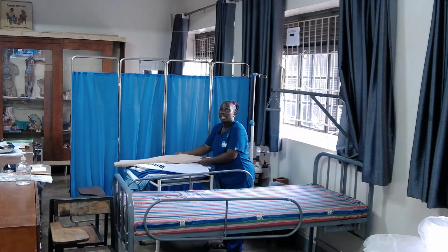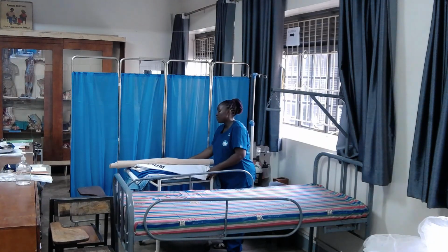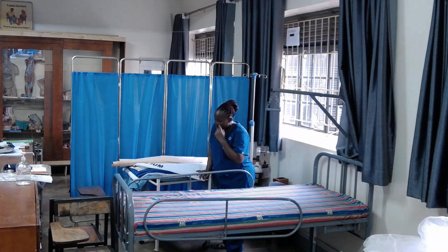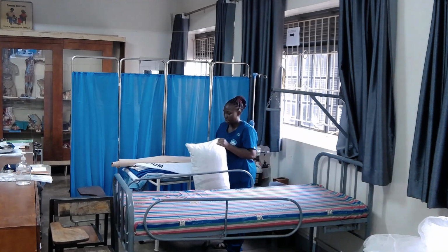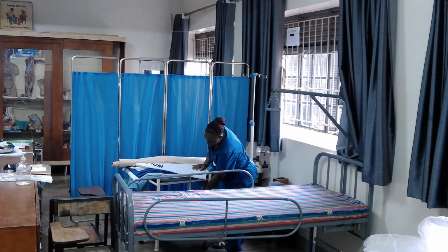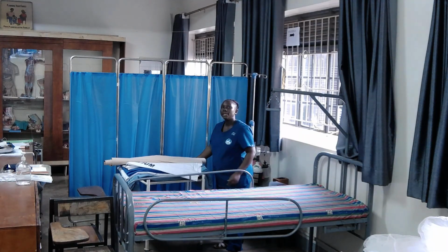So this bed is just a continuation of an admission bed. So that's why you're seeing we have 4 bed sheets, and you have the blue sheets as our admission sheets. Then we need a pillow, and then a draw sheet that we shall wrap this pillow in on our bottom shelf. So those are requirements on the trolley.